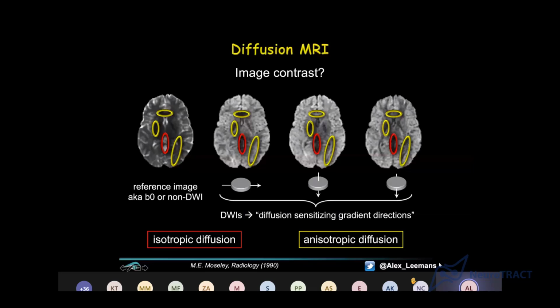And so if we look at the actual signal in those areas, there are two things that we can observe. First, in the left-right one of the diffusion weighted images, the signal is low. Again, a lot of diffusion means low signal. That's what we see. In the other orientations, front-back and up-down, we can see larger signals. And that makes sense, right? Because perpendicular to the left-right orientation, meaning front-back and up-down, molecules will have a much harder time to continue because of the barriers, the axonal fiber bundles. And so the signal will be high in those areas.